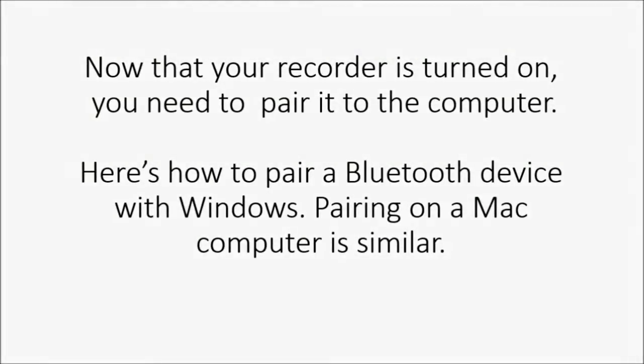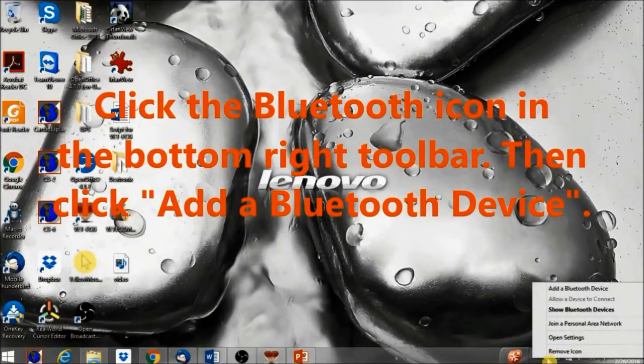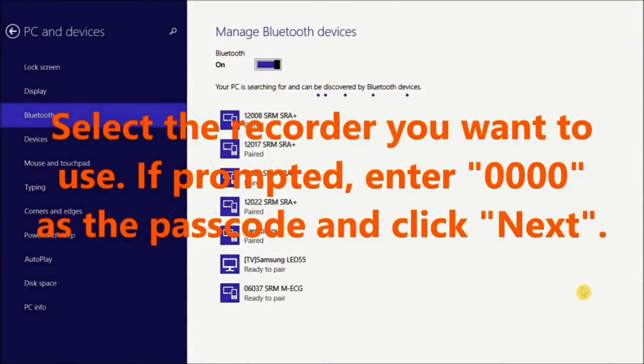Now that your Recorder is turned on, you need to pair it to the computer. Here's how to pair a Bluetooth device with Windows — pairing on a Mac computer is similar. Click the Bluetooth icon in the bottom right toolbar, then click Add a Bluetooth Device. Select the Recorder you want to use. If prompted, enter 0000 as the passcode and click Next.